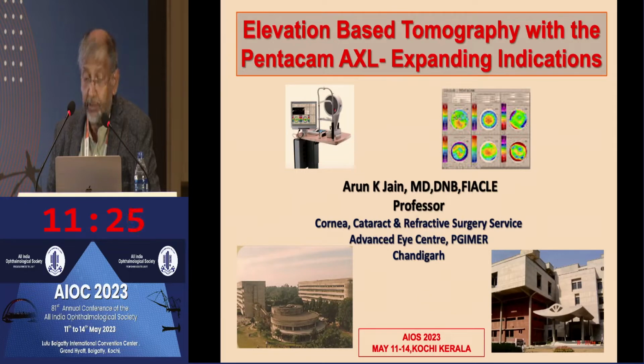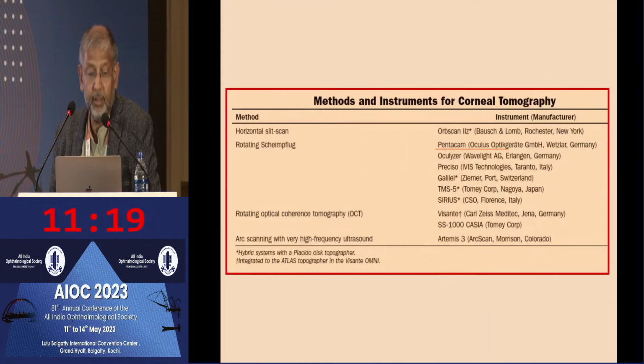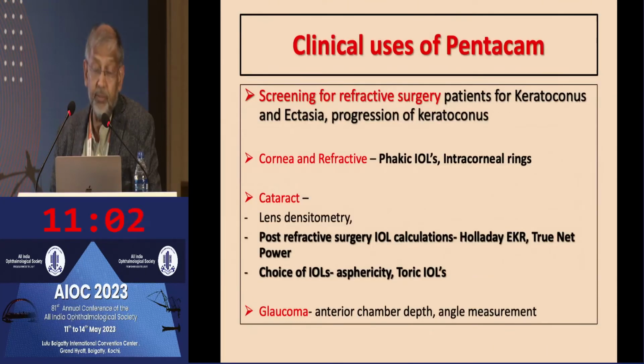So basically, as already highlighted by the previous speaker, there are various gadgets and instruments for doing corneal tomography, which are slit scan based rotating Scheimpflug as well as OCT based. And I'll be restricting my talk to Oculus Pentacam, which is based on rotating Scheimpflug scanning slit tomography.